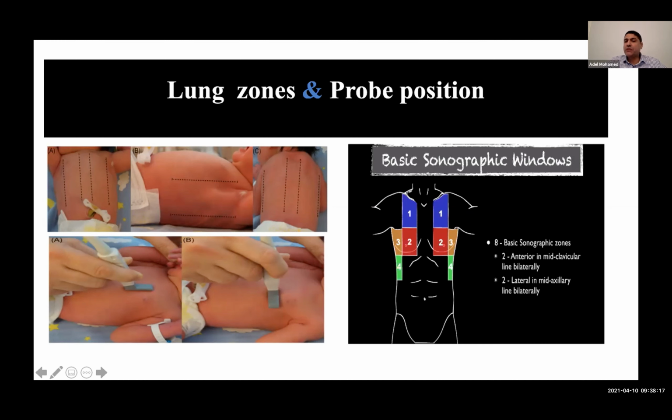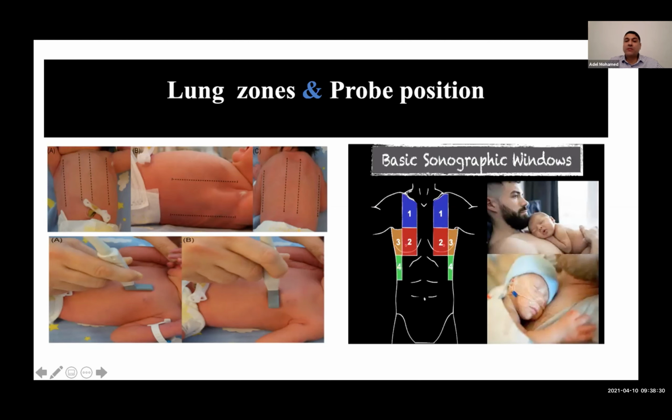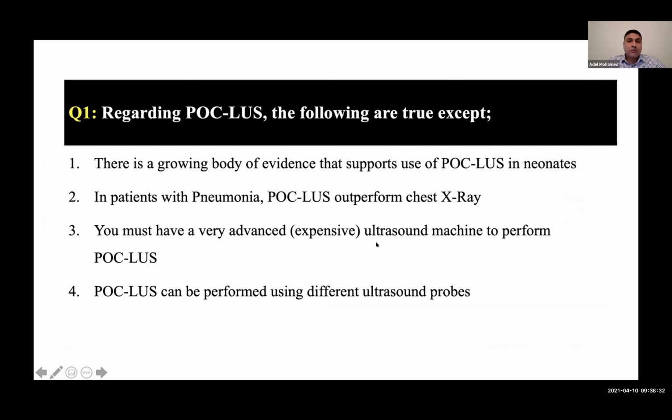This is to illustrate what we already discussed. Again, one of the beauties of lung ultrasound is that you can perform it while parents are holding the baby. You don't have to take the baby to the bed to do lung ultrasound, even if the baby is still on some oxygen. With this one, I prepared questions, but I might skip the questions again for the sake of time.